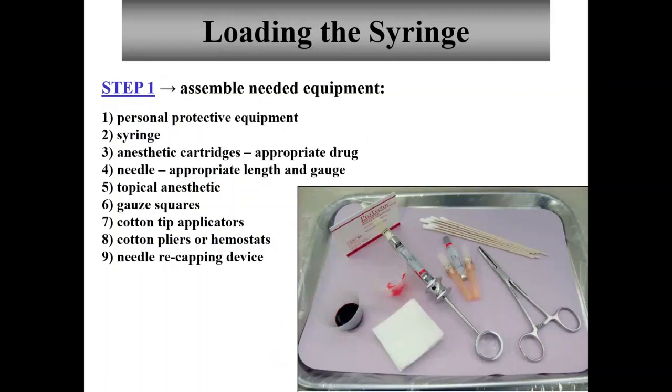So this goes through how to load a syringe. I have loaded a video under the Monday morning meetings under Collaborate, Blackboard Collaborate. You can go on there. I've loaded lots of videos, 5, I believe, and one of them is Armamentarium. You can click on that, go into Collaborate, click on that video, and it's going to walk you through the process of loading a syringe.